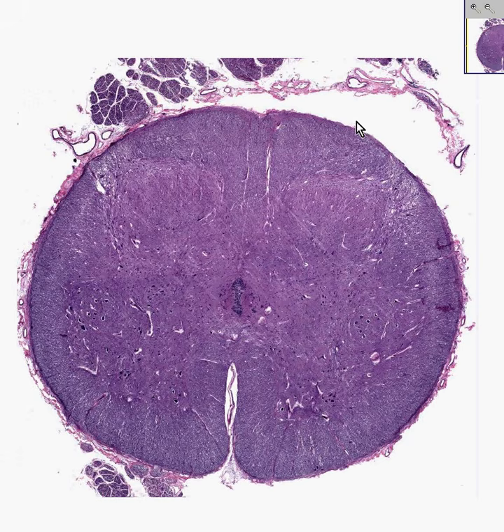And these nerve fibers out here are either dorsal or ventral or anterior or posterior roots of the nerves, and that's what's to be expected. And they aren't like any other nerve. They are nothing more than Schwann cells surrounding axons.